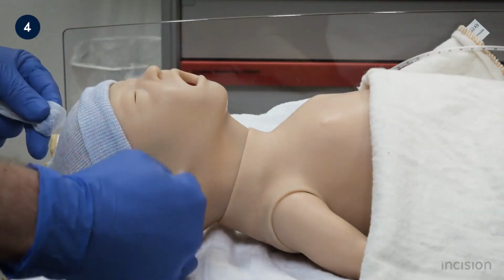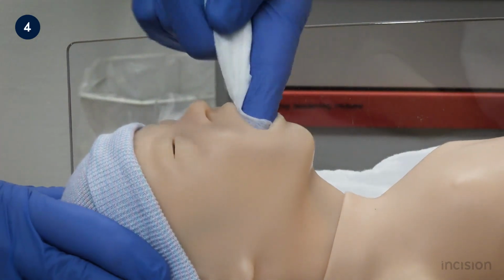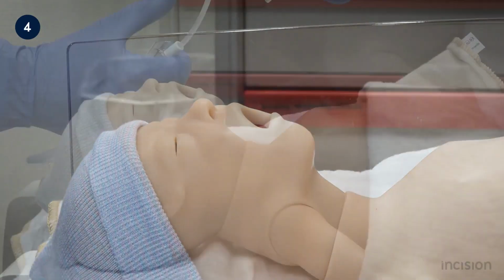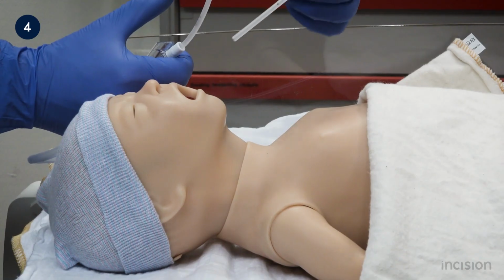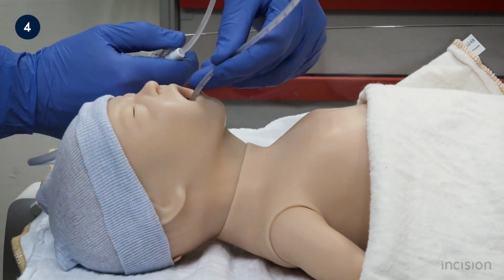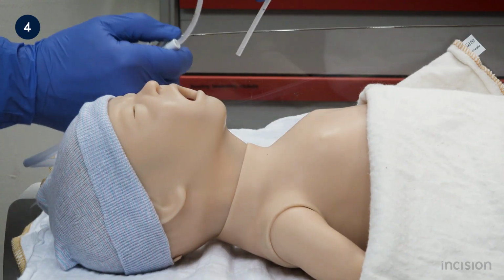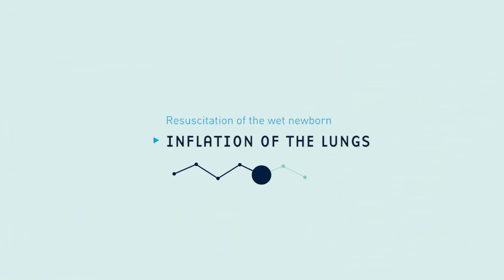The mouth is checked for obstructions and may be cleaned out using a gauze swab. Visible secretions may be removed using suction. If suction is used, it should not exceed 100 mm of mercury. Note that routine suctioning of the mouth is not advised. This is also the case in the presence of meconium-stained amniotic fluid, with infants who begin breathing on their own. Intubation of the newborn for the provision of a definitive airway will not be demonstrated in this film.